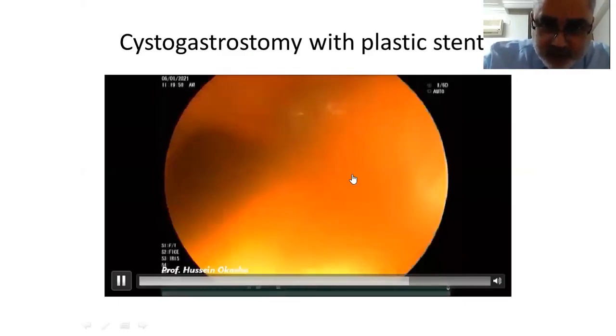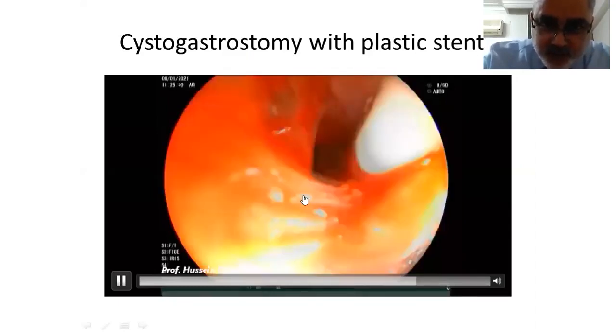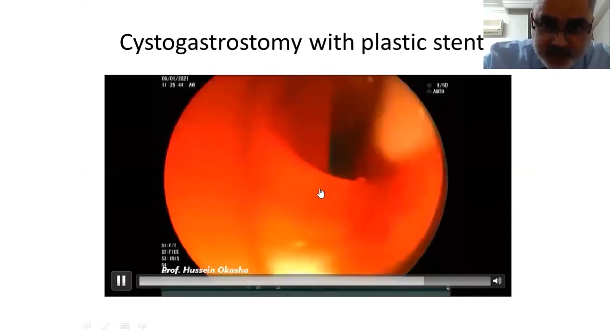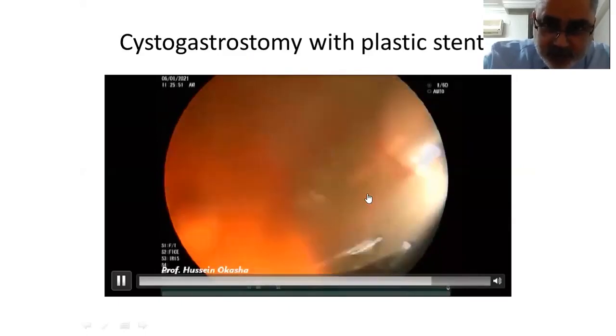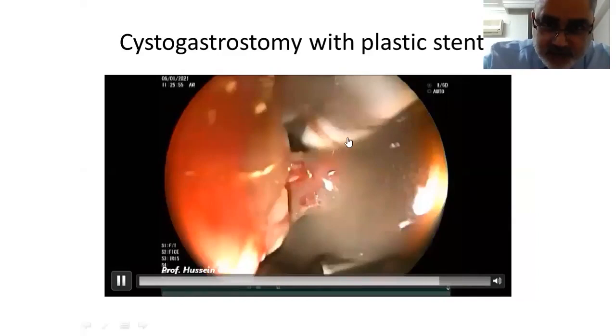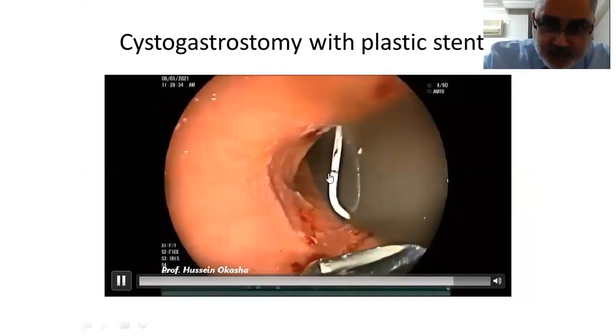And at that time, we see that there is a marked gush of fluid from the high pressure cyst to the stomach. And then we can introduce the double pigtail stent. And this is the marker of the stent. This is the distal marker of the stent. And then we should release the distal tip of the plastic stent.